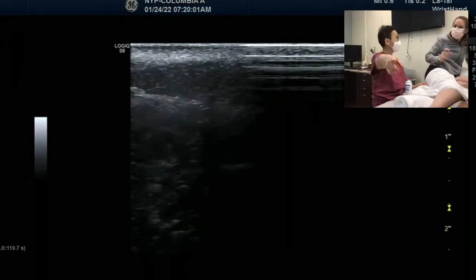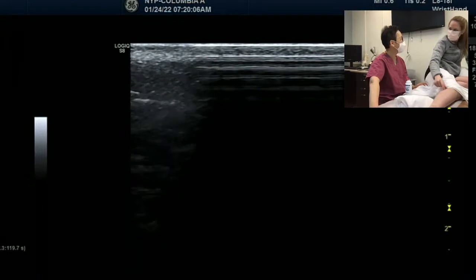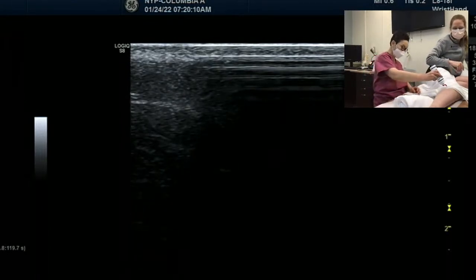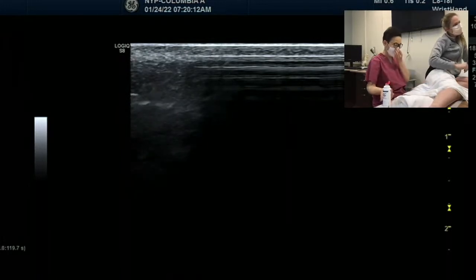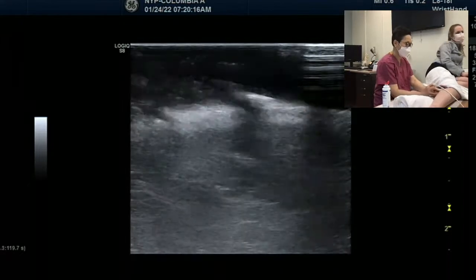But you wouldn't record it here. Oh, true. But for the blood vessels, I feel like the blood vessels might help us find it. Let's find out. Oh, my neck hurts. Okay, we're gonna go middle again.